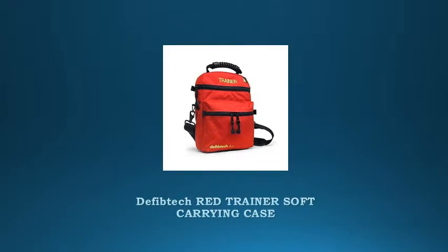DefibTech Red Trainer Soft Carrying Case. This case is designed to hold the trainer AED and accessories. The case is made of ballistic nylon and has a durable carrying handle. The distinctive red color matches the color of the trainer AED, and together with the embroidered trainer label, clearly indicates that the unit inside is a training device that cannot be used to defibrillate a real patient.